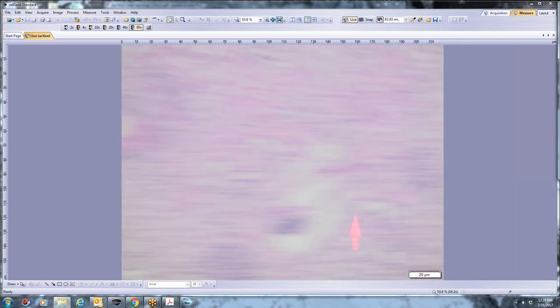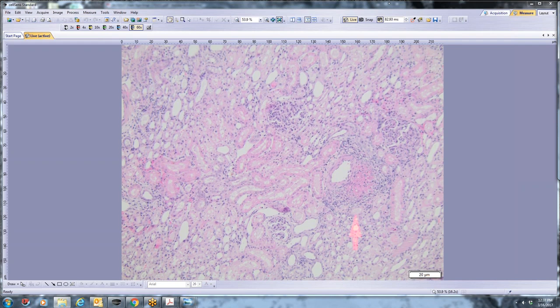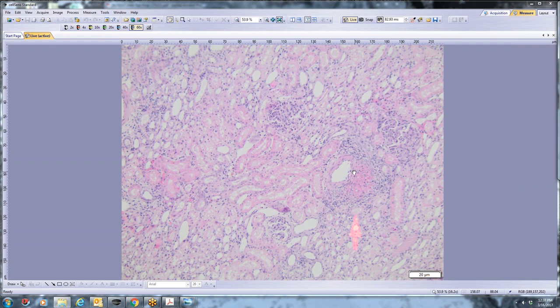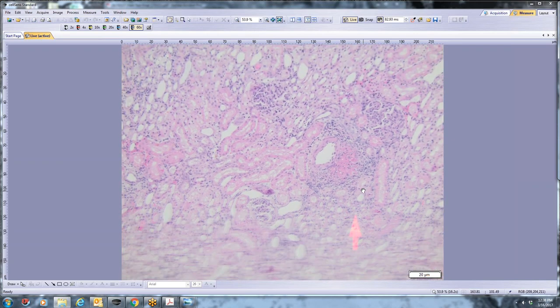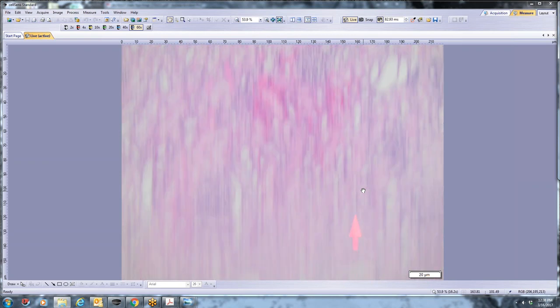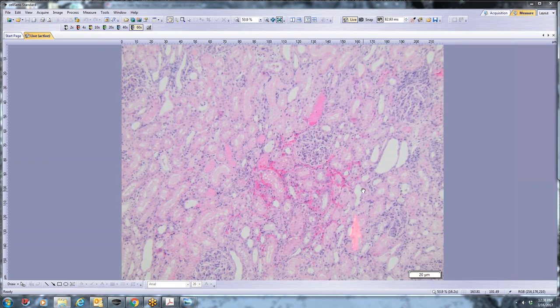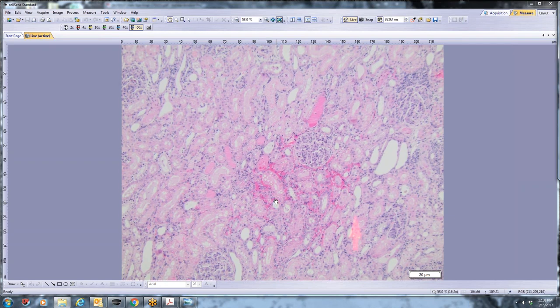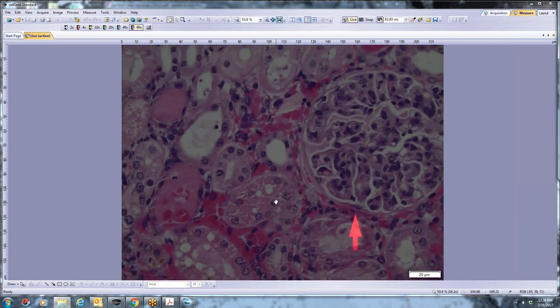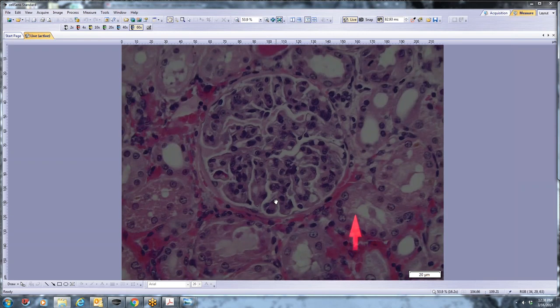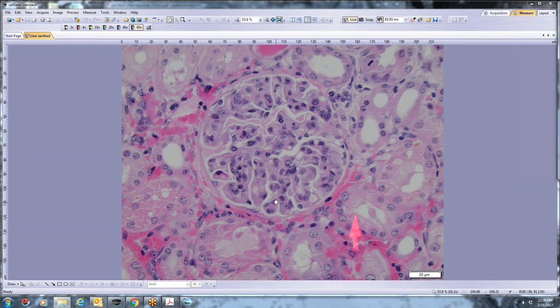And then also at this mag, as we're going along and looking at some of the vessels, we have a few, at least this one particularly, that has fibrinoid necrosis at the surrounding the vessel with an associated inflammatory reaction. So this is a little bit more generalized inflammation than the previous case. And then the other thing that's a little bit more striking also is the degree of interstitial hemorrhage. So whatever has hit this particular case didn't just hit the glomeruli, it's probably also hitting the peritubular capillaries.